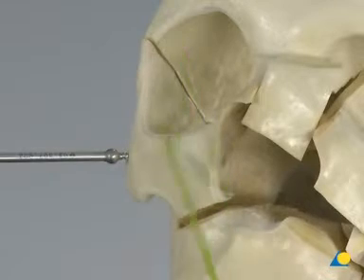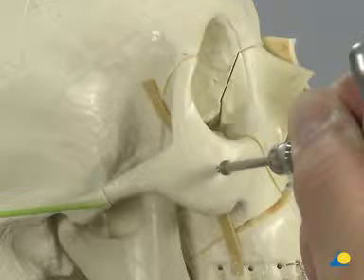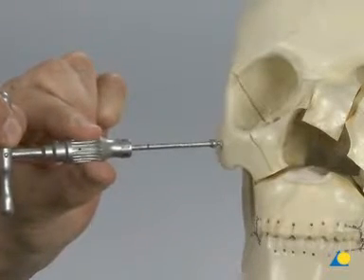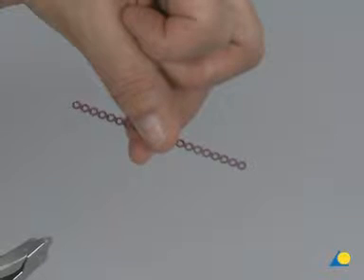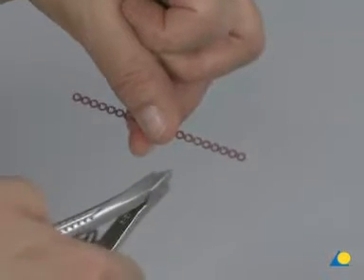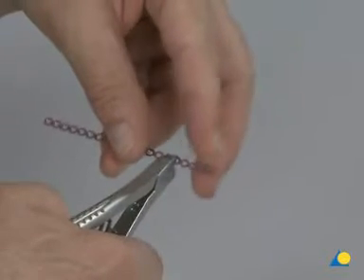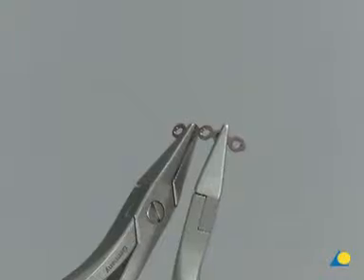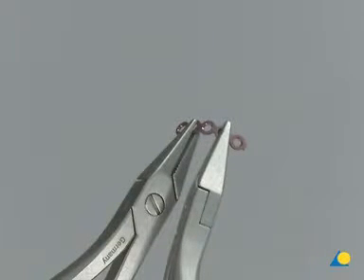The T-handle is used to manipulate the bone fragment until the fractures are reduced. The reduction of all the fractures is checked, and the T-handle is removed. A 0.7 mm thick, 20-hole long adaption plate is selected and trimmed with the plate cutter to five holes. This five-hole plate is contoured to the shape of the lateral orbital rim using two standard plate benders.